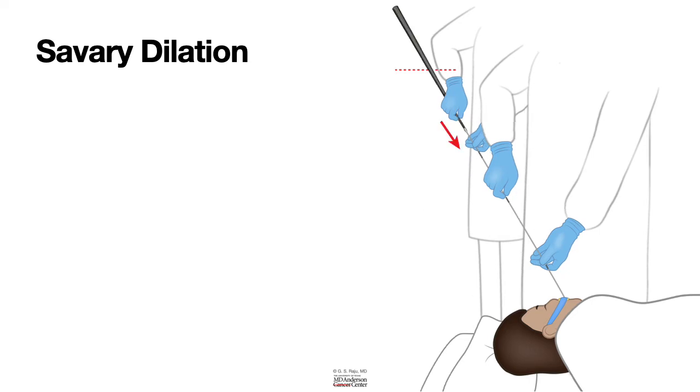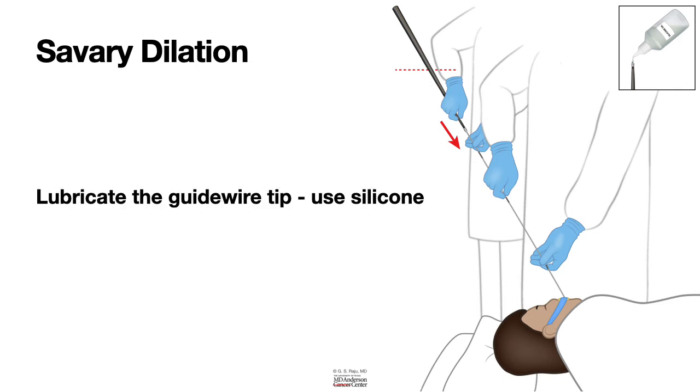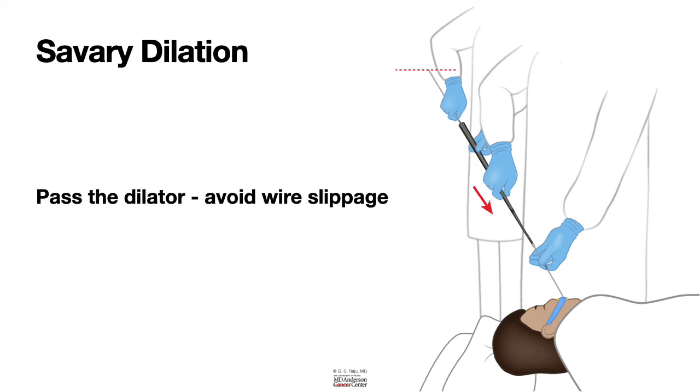Then you lubricate the end of the Savary tip with silicone oil, and that way the dilator can slip on the Savary wire easily. So the next step is lubricating the guide wire tip with a little bit of silicone. You must keep the wire straight without loops. Make sure you hold on to the end of the wire at a fixed distance from where you started, and you pass the dilator and avoid wire slippage.